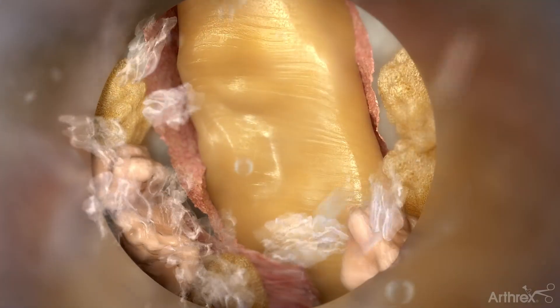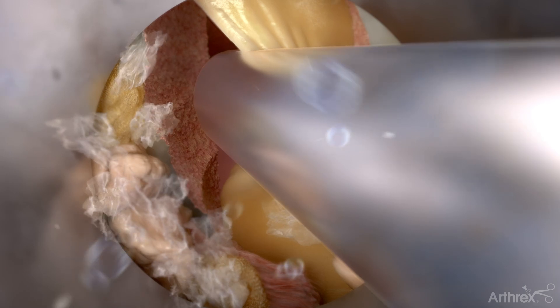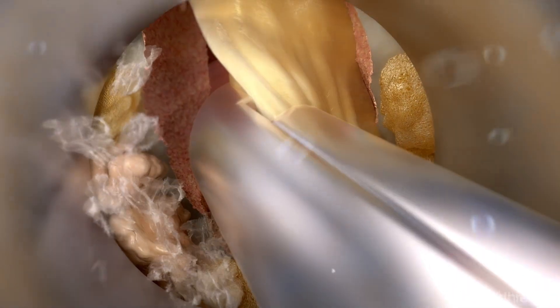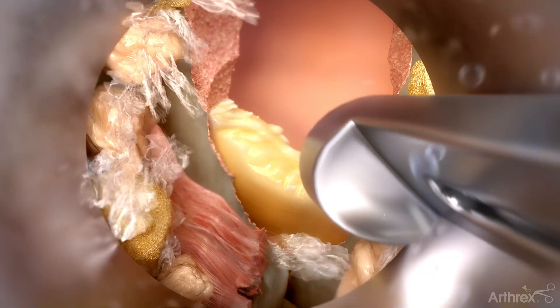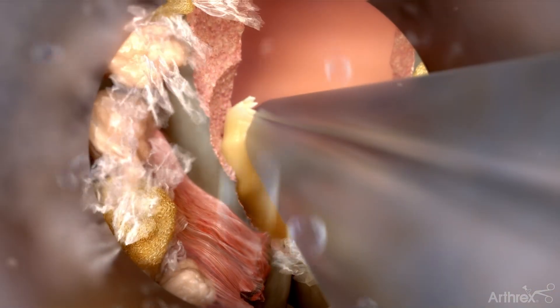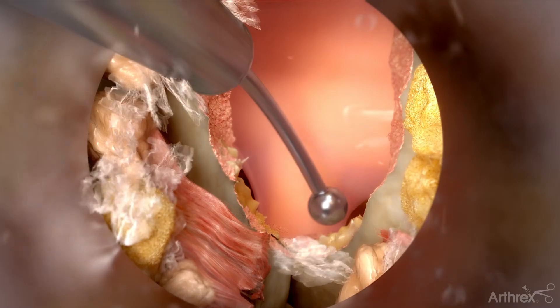Larger pieces of the ligament can be removed by partially biting down on the ligament, twisting, rotating, and then removing. Once the bilateral decompression of the thecal sac has been performed, the next step is to address any pathology in the foramen by using a Kerrison to decompress over the exiting nerve root.